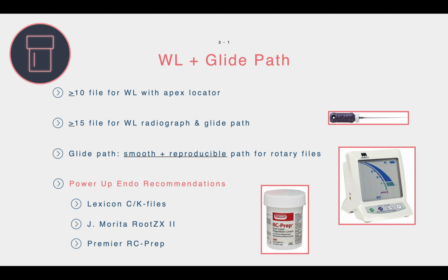And when you're obtaining your working length, you want to finish your instrumentation, or obtain your working length, to what you see here in the image. That midpoint between the number 1 and the apex. That's going to give you a nice endpoint right at that apical constriction.